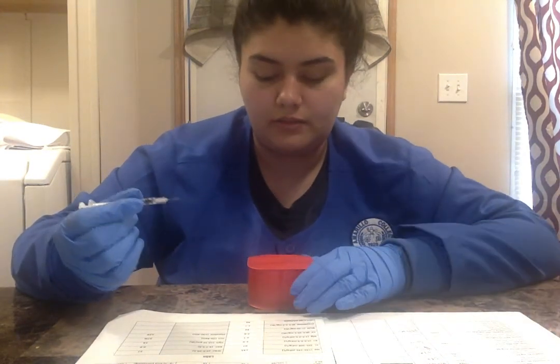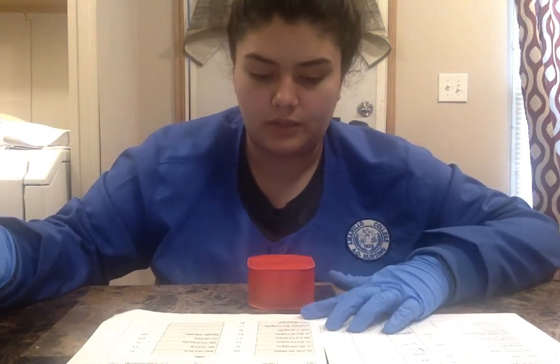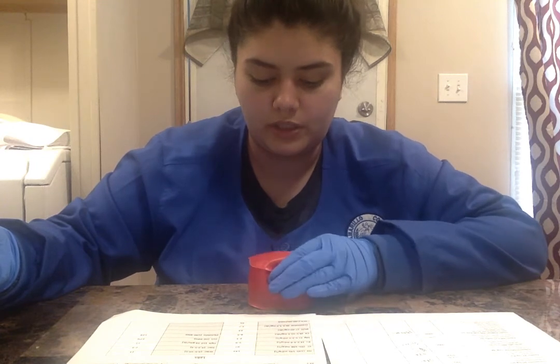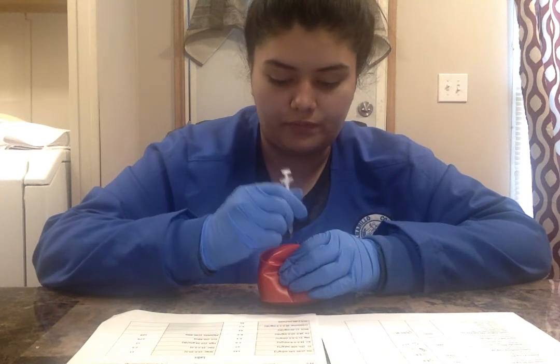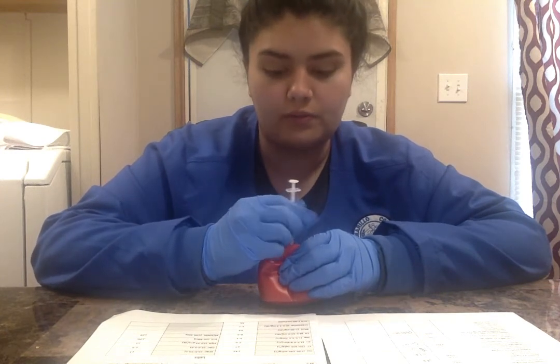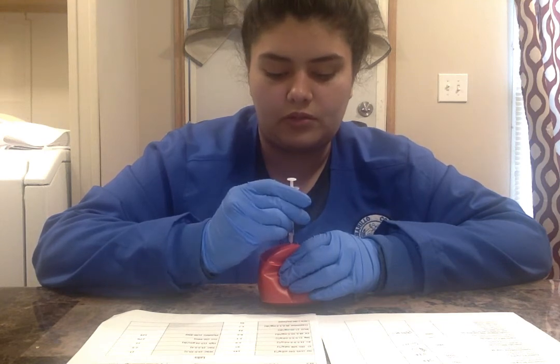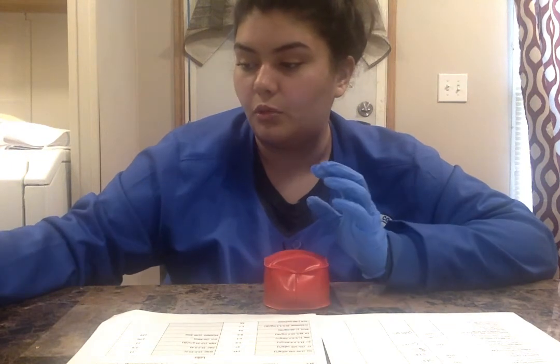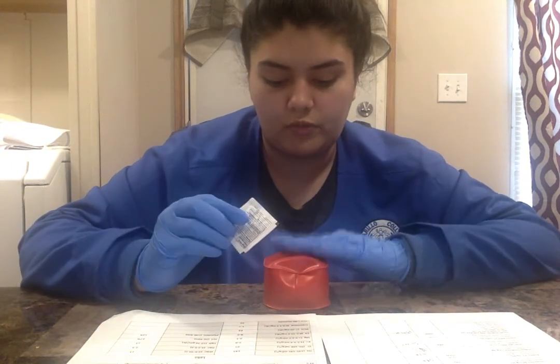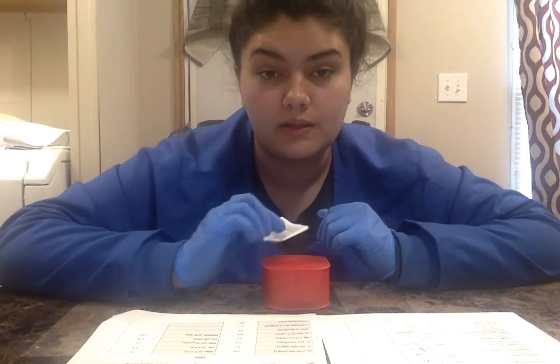I have already cleaned the injection site. And now I'm going to give her medication. I'm going to pinch the skin, make sure that all of it is pinched. I'm going to go in at a 90 degree angle. If she was skinnier, I'd go in at a 45 degree angle. I'm going to inject my medicine. I'm going to pull out the needle. I'm going to throw that in the sharps container. So all that goes in the sharps container. I'm going to get an alcohol swab, and I'm going to gently wipe, but I'm not going to rub it in. You do not rub in insulin.